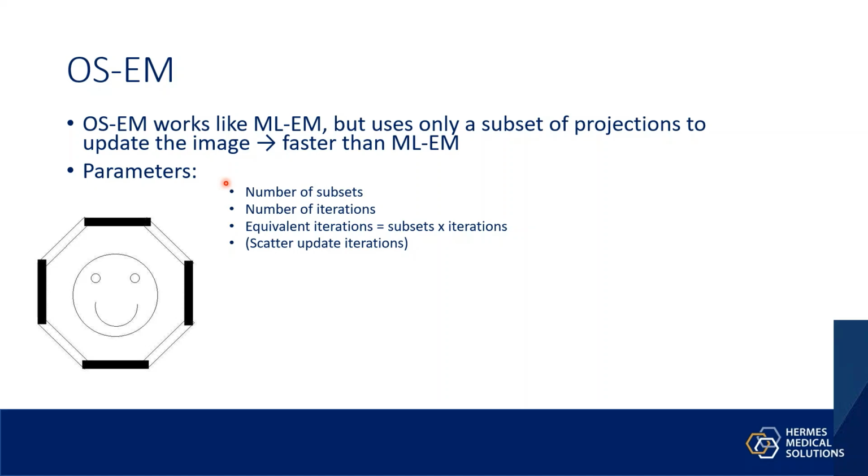that OSEM has been widely accepted, and it's the best-known and most-used reconstruction algorithm in both SPECT and PET. The OSEM algorithm was developed by accident by Richard Larkin. He was implementing the MLEM algorithm, but he made a coding mistake, and then he noticed that his coding mistake made MLEM much faster, and that was how OSEM was born, maybe 20 or 25 years ago. But now it's the most common reconstruction method in SPECT.